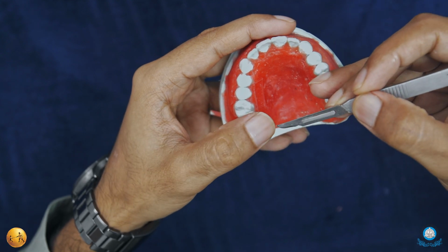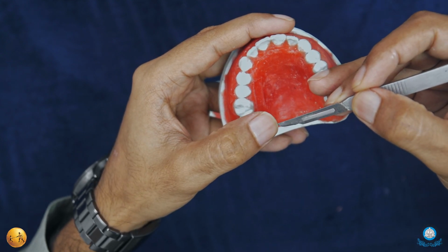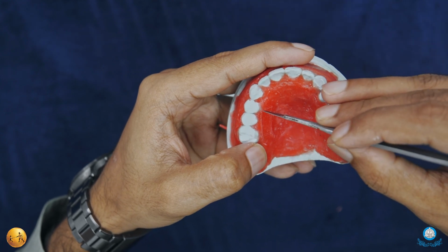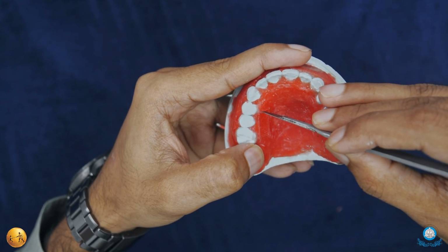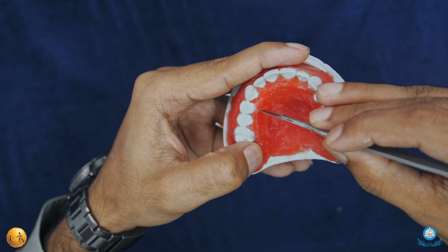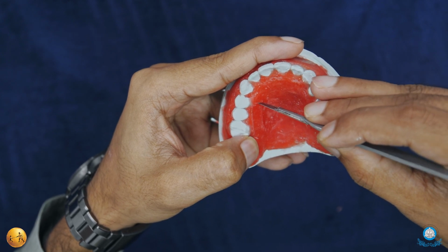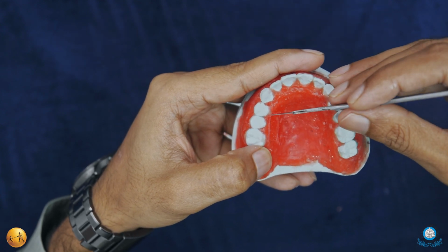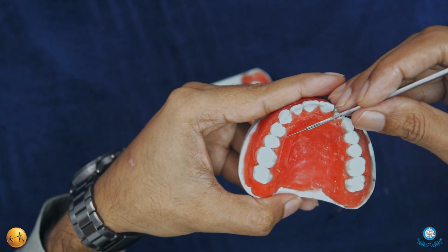A general idea is that however much bevel is present on a 15 number blade, that much depth can be achieved. You can insert the beveled portion into the epithelium and connective tissue, and that could give us an idea of 1 to 1.5 mm of thickness.